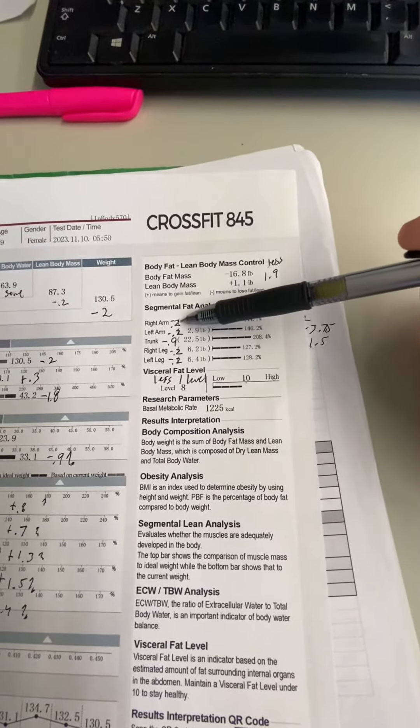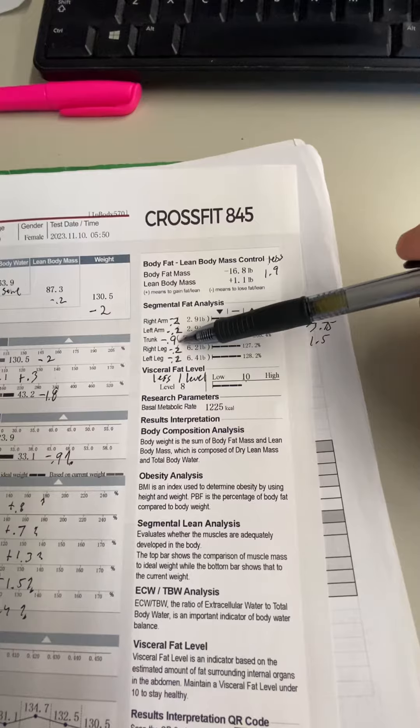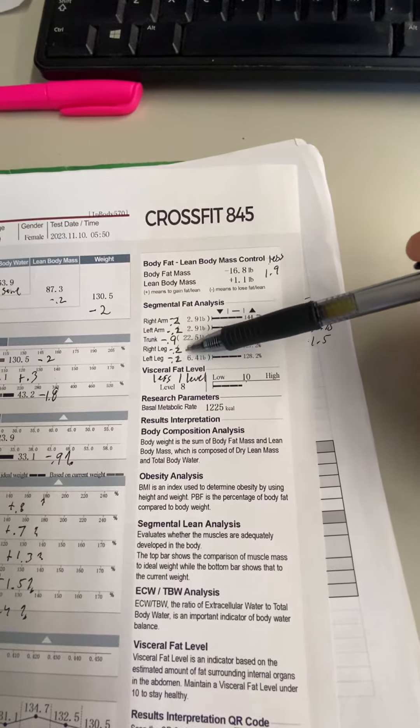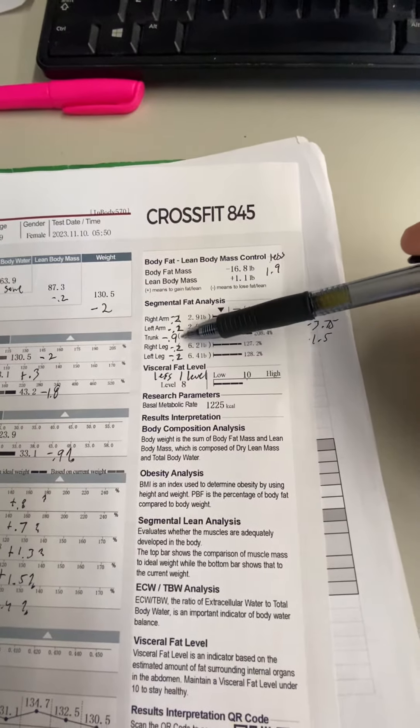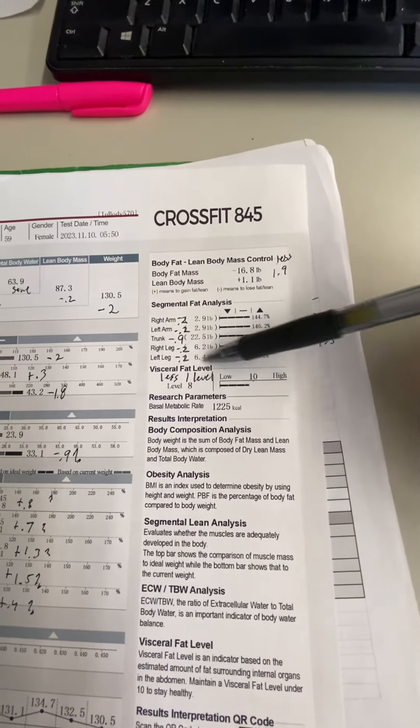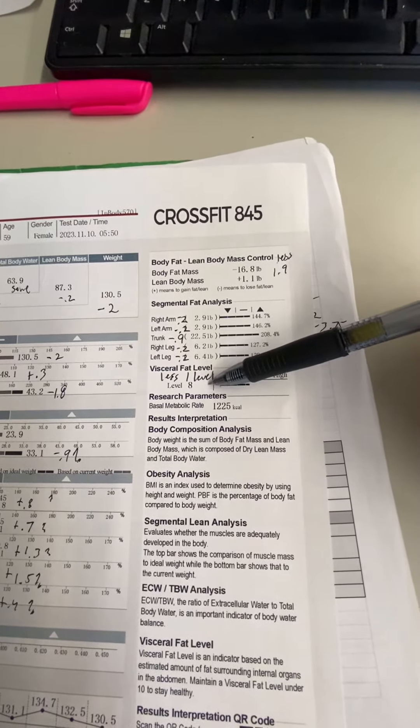Where did you lose the body fat from? 0.2 pounds off of your arms and legs each, and then almost one full pound off your trunk. And then your visceral fat levels went down another level, which is great.